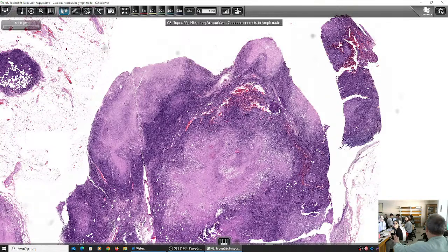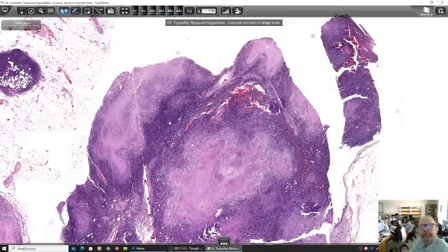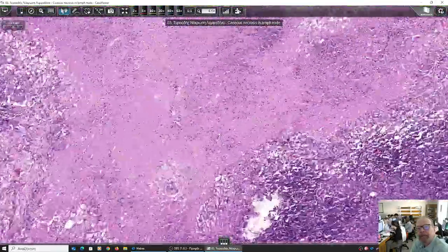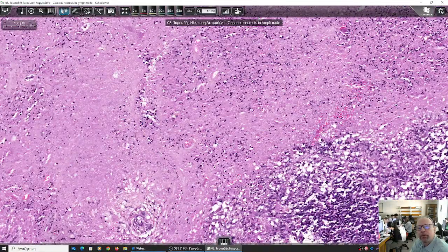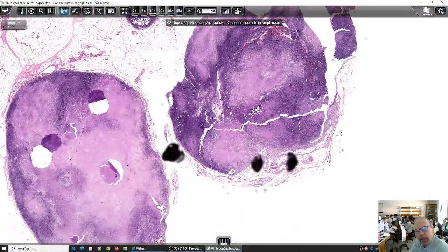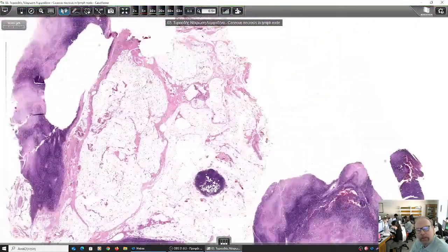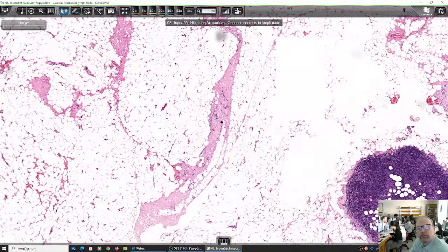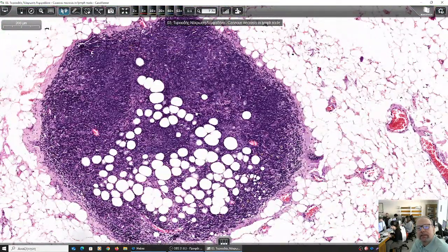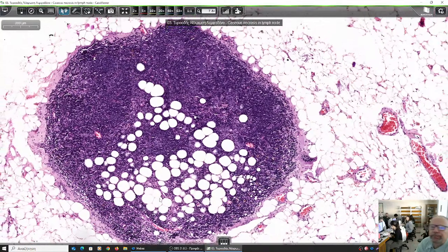So if somebody is examined on this slide, what will he show? Where is the normal lymph node parenchyma? Here it is. This is the normal, okay? Where is necrosis? That's necrosis, okay? And with nuclear dust. And what is this necrosis? Caseous necrosis. So Ziehl-Neelsen histochemical stain is mandatory to diagnose tuberculosis. This is fat tissue, and this is another lymph node with some fat cells in it.